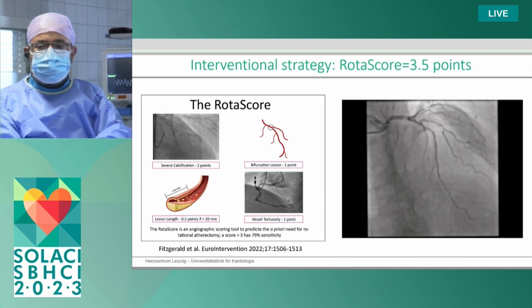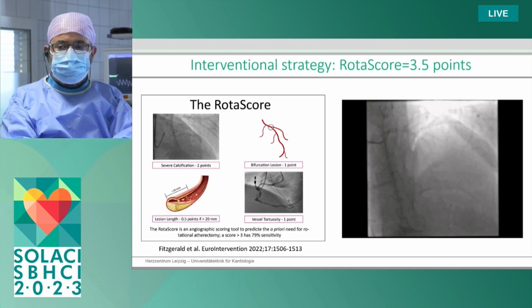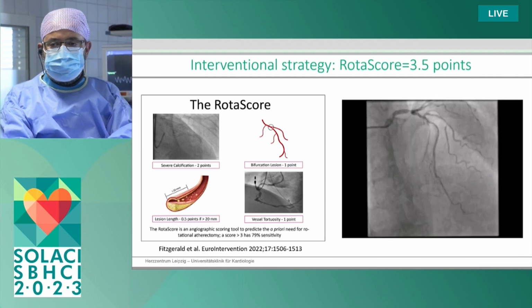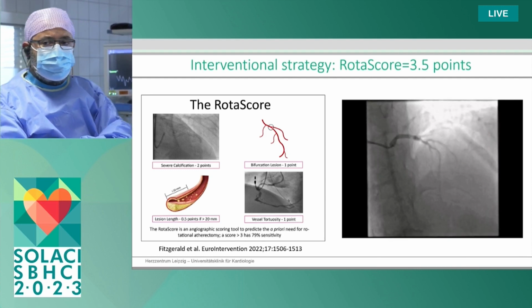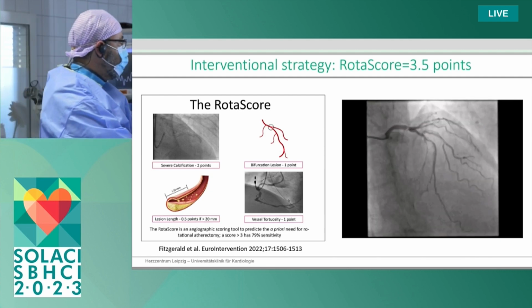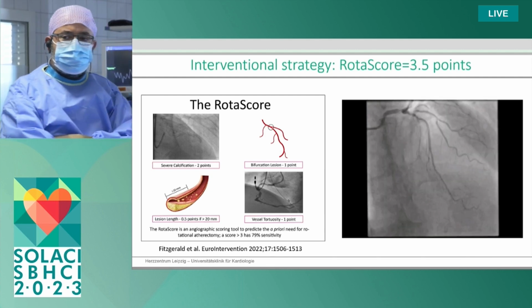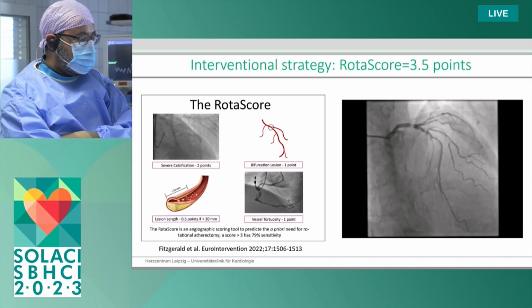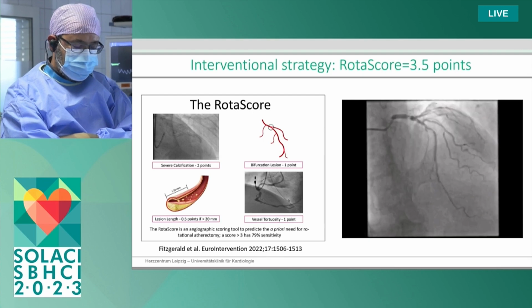And then you can try to base your decision-making on intravascular imaging, which also requires assessment of different factors. Our feeling was that probably the IVUS catheter would not pass this lesion because it's very tight. And so our decision here was based on fluoro or angiography.